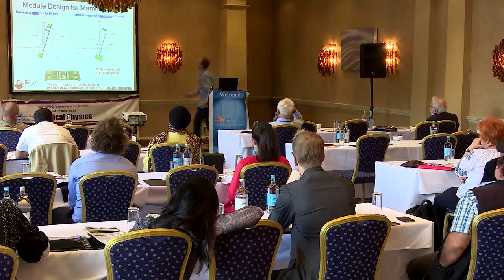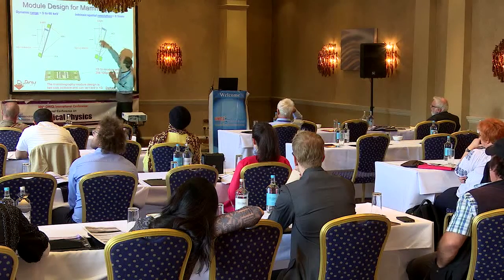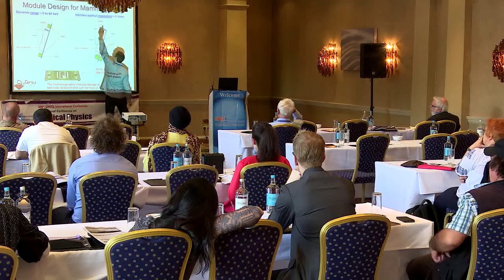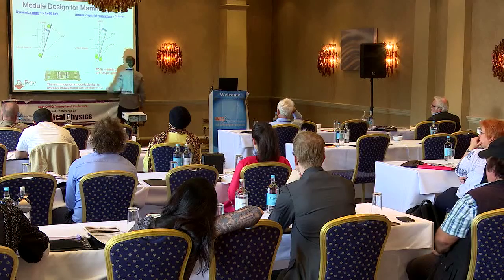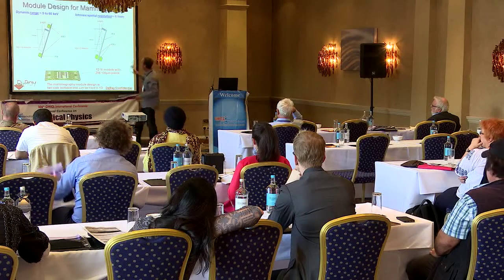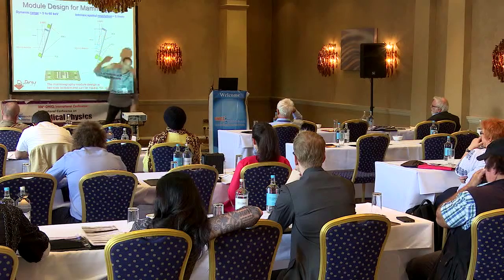So what we do here is we use an edge illumination. Now this has the advantage that the charge is collected across the narrow junction, so we can use very, very fast peaking times to collect the charge very, very quickly. But by using an edge illumination, we still get a lot of silicon to have a high DQE for the X-rays. Silicon strip detectors have a guard ring around the edge, and the guard ring creates a dead space in silicon, so it's not directly edge illuminated, but edge illuminated at a slight angle.